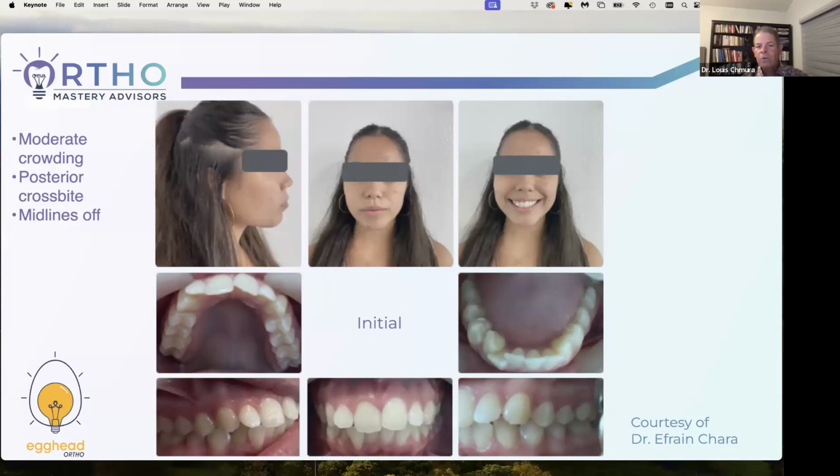So what are you going to do to fix it? You want to upright the lower teeth, but that means taking the upper ones and tipping them out. Are you going to tip them out too far? Because you got to go quite a ways. You can't fix the kind of crowding you see on the lower right unless there's visible space between those teeth when you move them, when you rotate them. That lower lateral is not going to come into the arch without space.